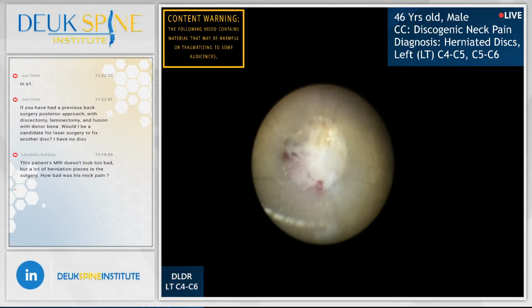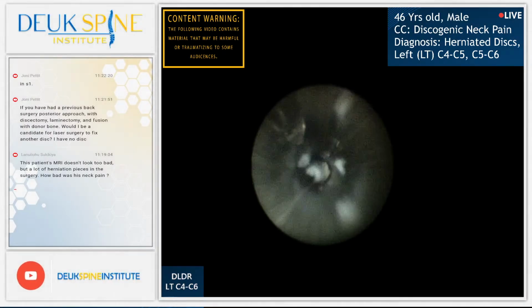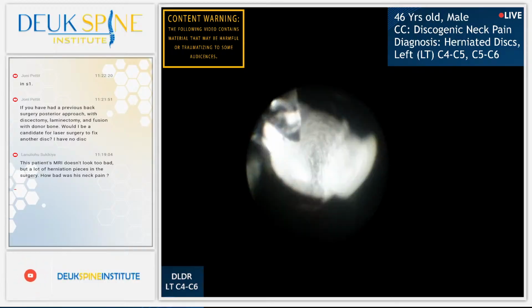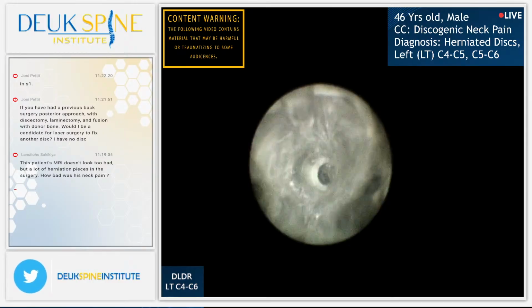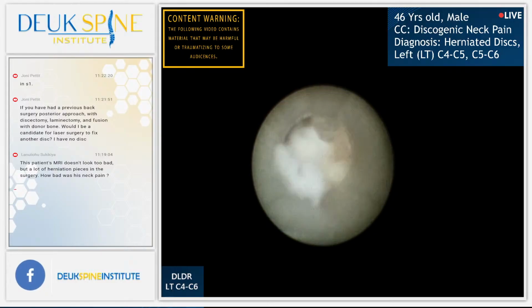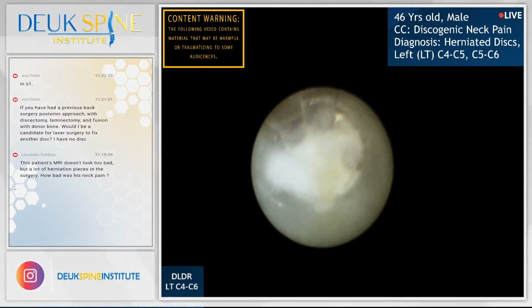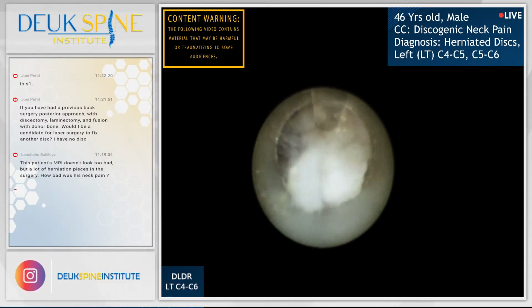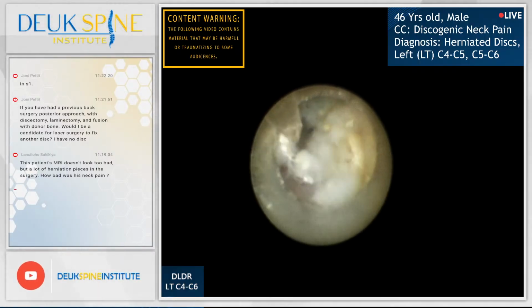All right, guys, I need the irrigation working properly. Jordan, my friend, can you go take a look at that irrigation? There we go. Okay, so understand what you just did to make it work and make sure you do that first next time. Okay? You want to share with us what you learned about the irrigation? Yeah, certain bags, the spike needs to go deeper, I guess, depending on the bag. I love it. Good job. Self-discovery, very important.